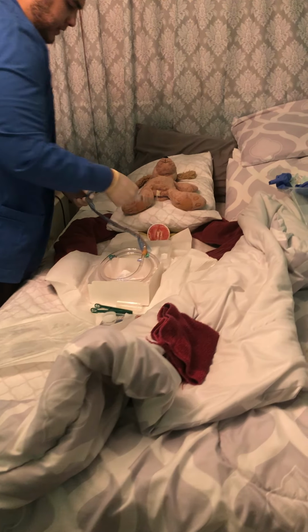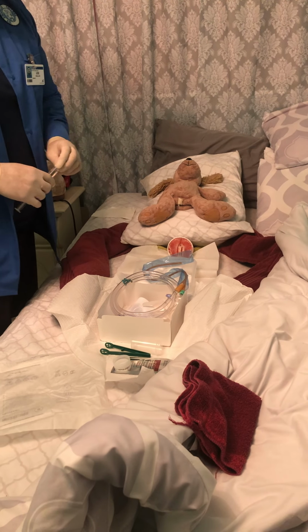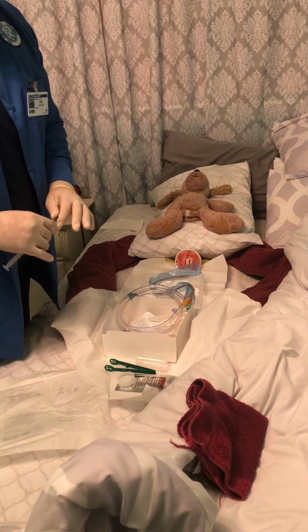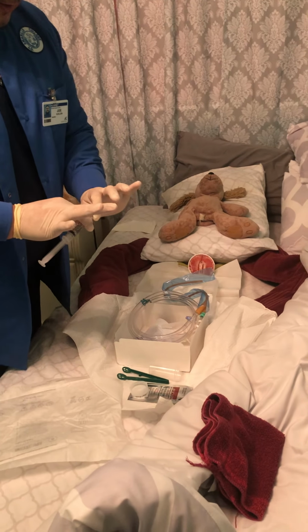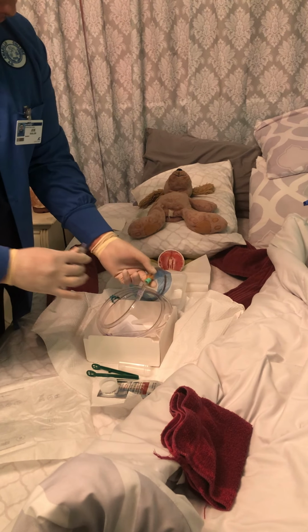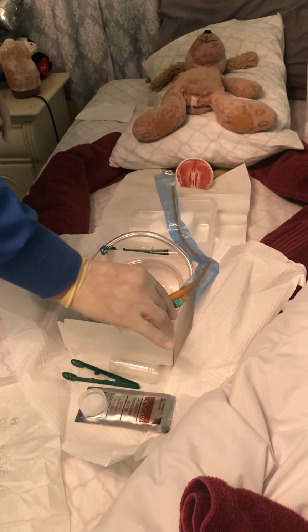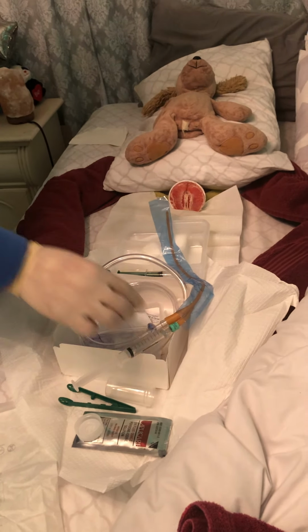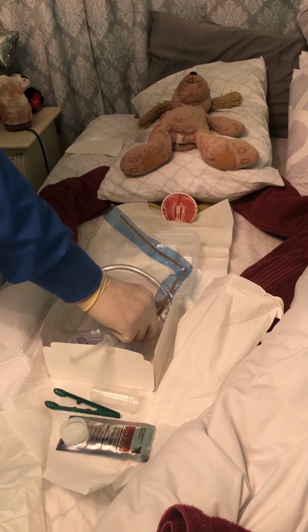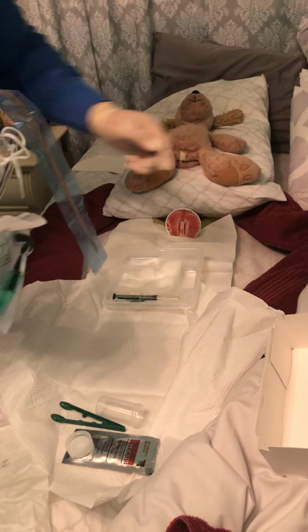So we're gonna go ahead and get the catheter ready. So you want to go ahead and get this and just have it ready to inflate the balloon. Move that there.